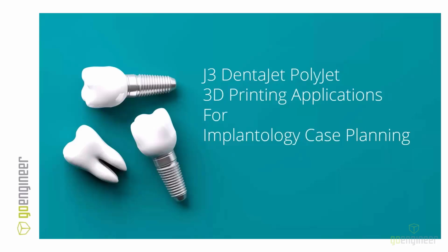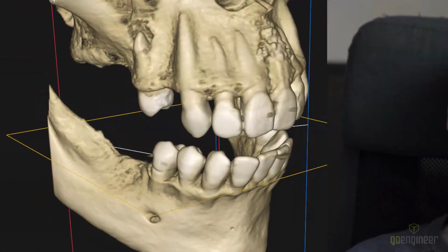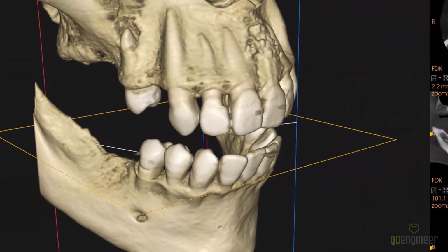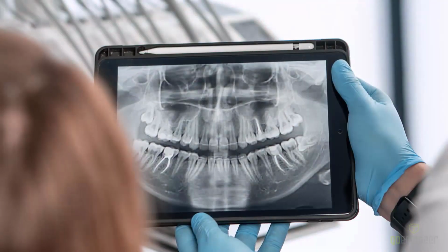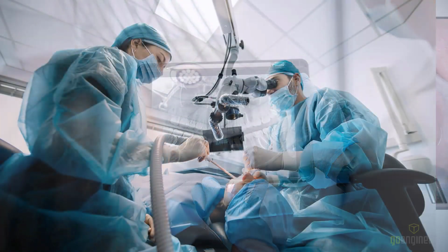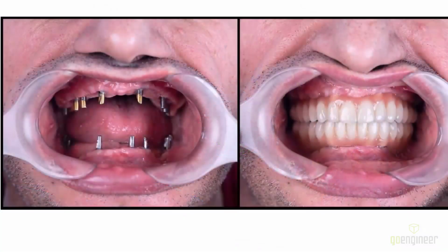I also want to point out that this is a webinar that is open to general population. And so not everybody is going to know about implantology. So just real quick, if you have a patient that has serious dental issues, perhaps they're edentulous, they don't have any teeth, a workflow that we use today, and it's highly digitized, where we're taking medical imaging data and combining it with 3D CAD data to be able to do precise planning of how we're going to approach installing the implants into a patient's mouth so that we can then attach the external portion of the implant.